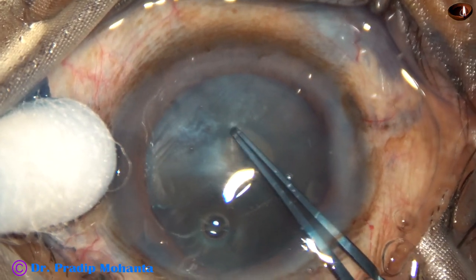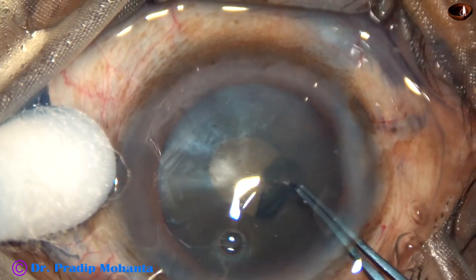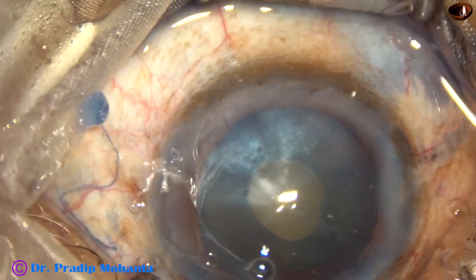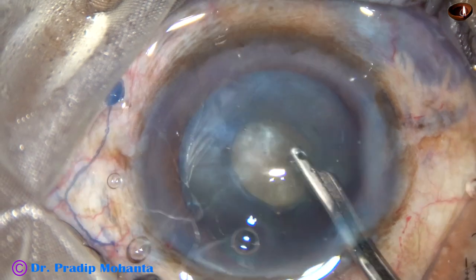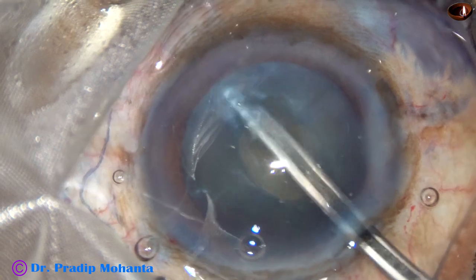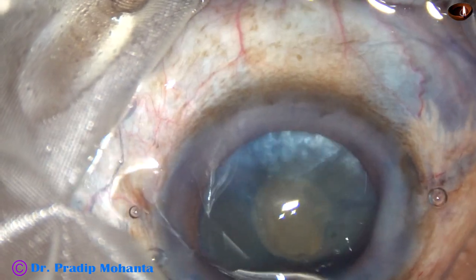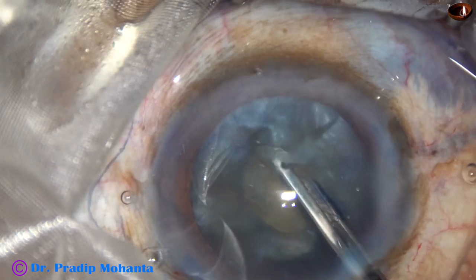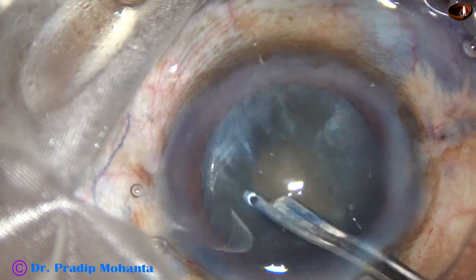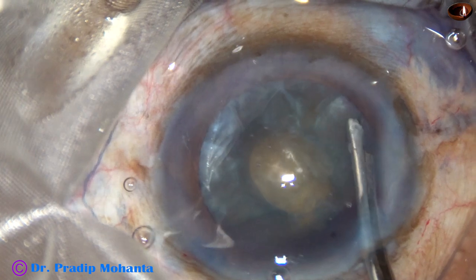In intumescent cataracts, I always do two-stage rhexis. First, a mini rhexis, and then aspirate some cortical lens matter through this small opening, so the intralenticular pressure is reduced.